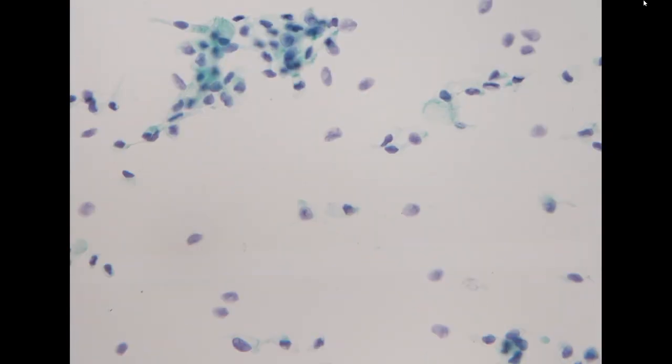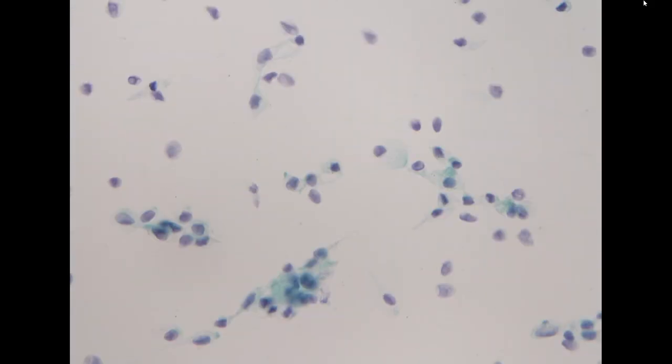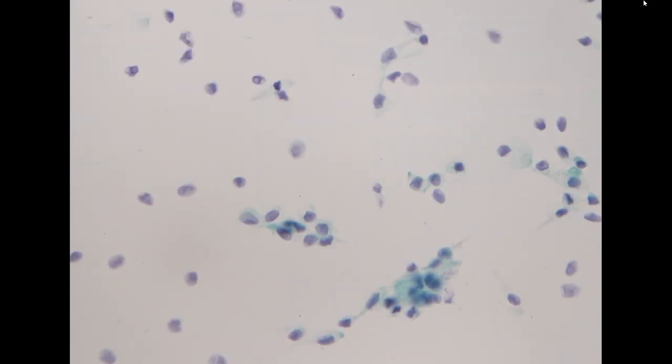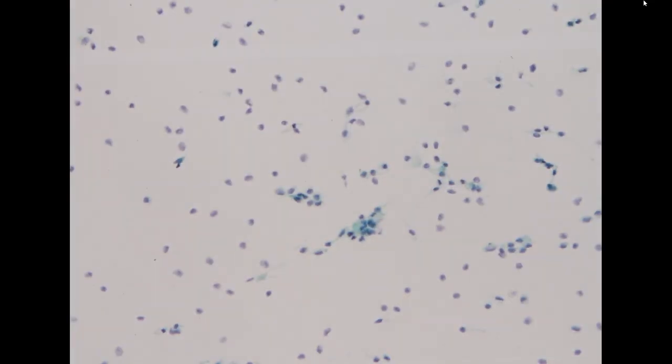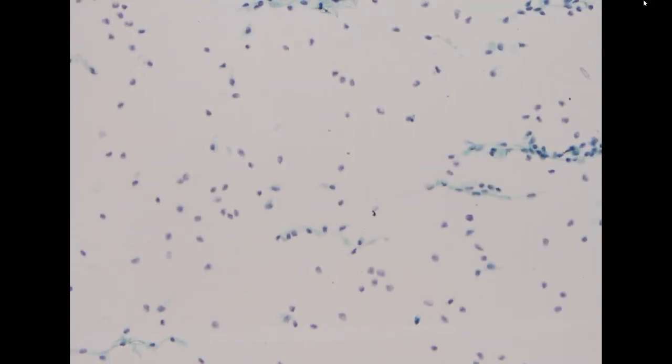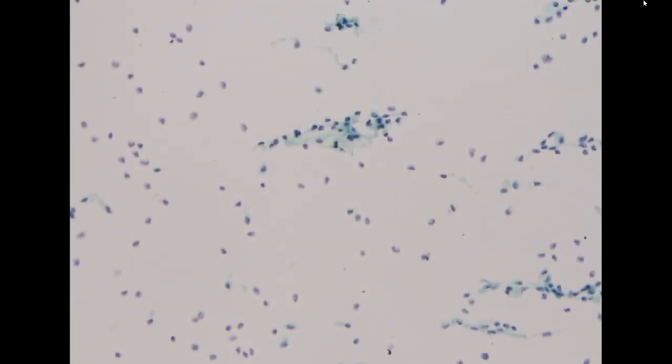But it is very difficult to address low-grade urothelial neoplasm because the diagnostic clues are variable. It's not very uniform. However, in two circumstances, we can highly suggest this is a low-grade urothelial neoplasm. This is the first one.